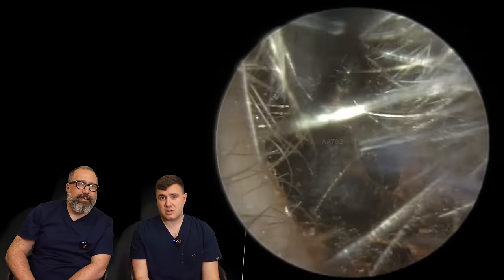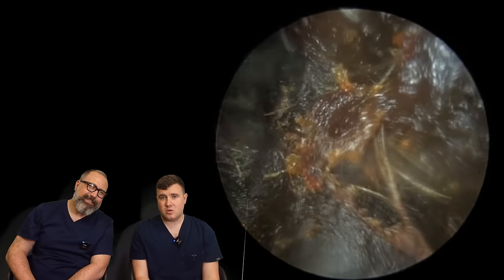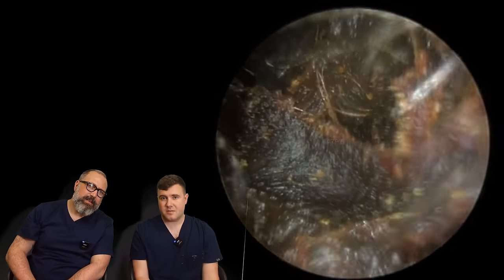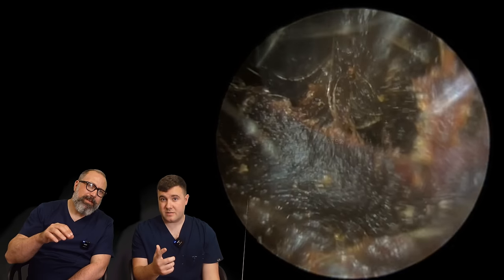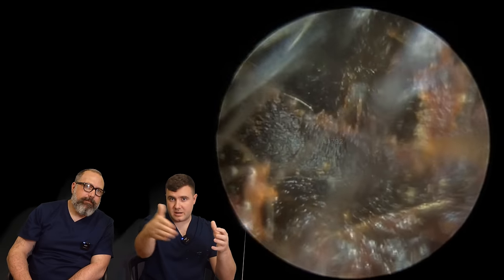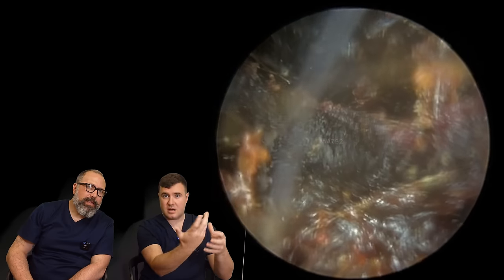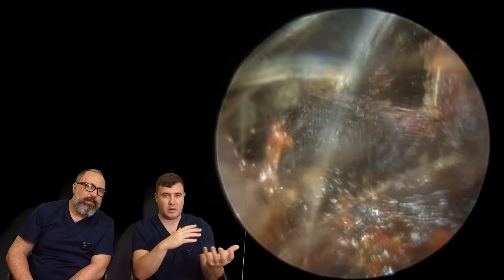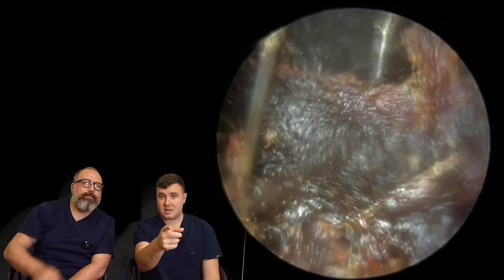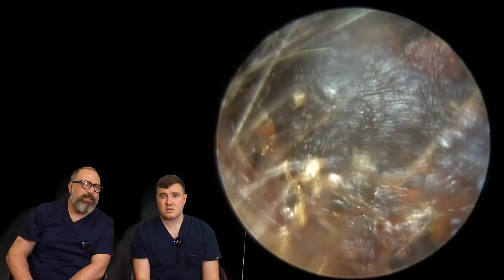I'm really just hoping that this is going to have some movement. I'm a bit dubious about putting any oil in at the moment, just purely because of the view — I don't want it to start fogging up and blurring. I'm popping this in and going in a sort of arc motion, not straight down. I'm trying to bring this forward — you can see this starting to move here now. That is tough pressure to get right as well. Too much, you pull straight through; too little, it doesn't budge.